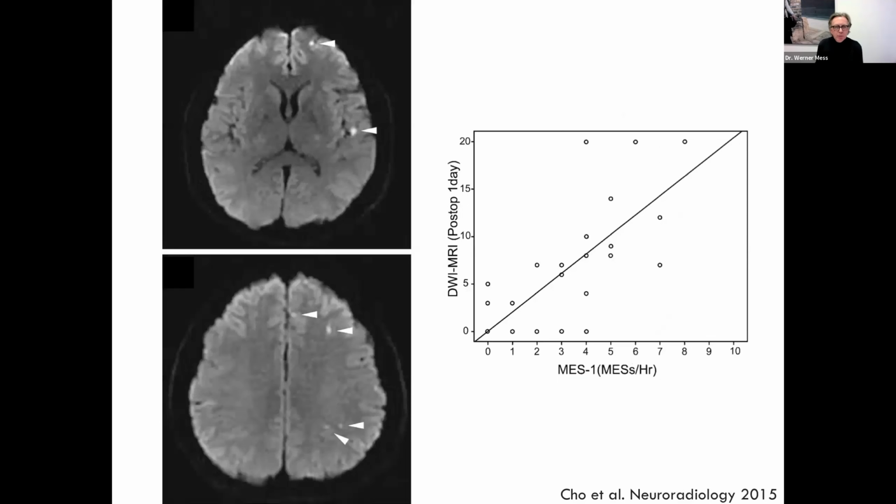Okay, so the same concept has been proven by a more recent study. This is a study in patients with intracranial pathology, and these authors found a clear-cut relationship between the amount of emboli and the amount of new lesions on post-procedural MRI.